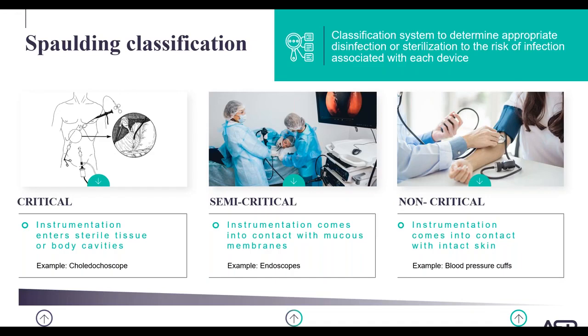Semi-critical devices, on the other hand, are those that come into contact with mucous membranes. And an example of this might be a flexible endoscope. So high-level disinfection is the minimal method for reprocessing these devices. However, and it is important to note, depending on the device, it may also be validated for sterilization.